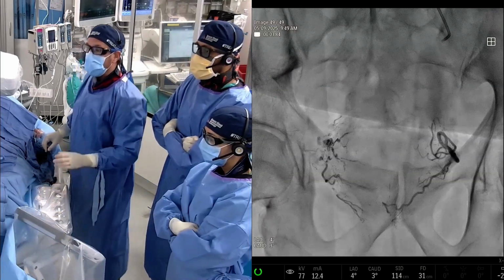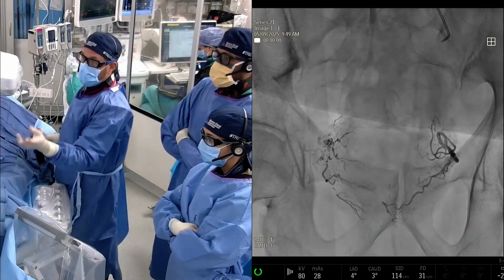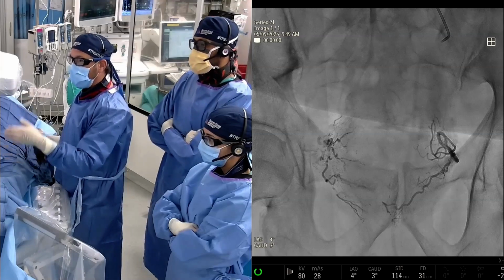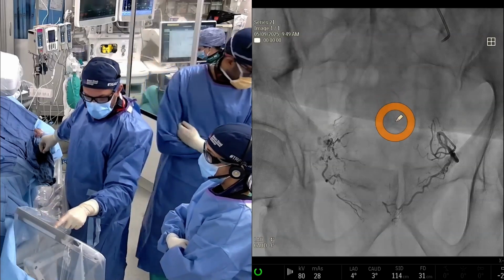So as Art mentioned, we like to see one picture of the penetration. I think on the right side we probably have a 2, and on the left side we probably have a 3. And I use the midline, right? Art, do you want to walk us through what we're talking about here? I'm going to draw a line right through the midline on the screen here.